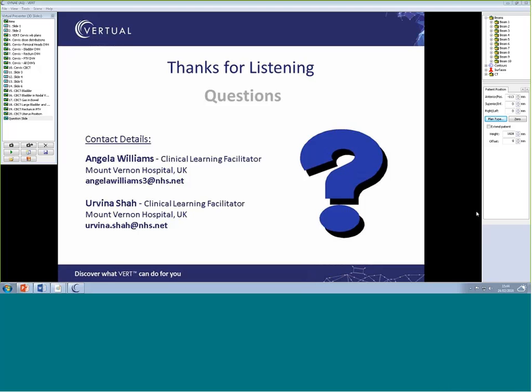I'm certainly quite keen to try and use these sessions at UE. We've just revalidated our program, and we've been making much more use of VERT and of our new Eclipse planning system here for our first years. I can just really see how this would build on that knowledge in year 2, and I think we've got an ideal opportunity to try this with our year 2 students. So I shall certainly be putting this to my team to have a go at one of these sessions and see how useful they are. So I'd just like to echo everybody's thanks.